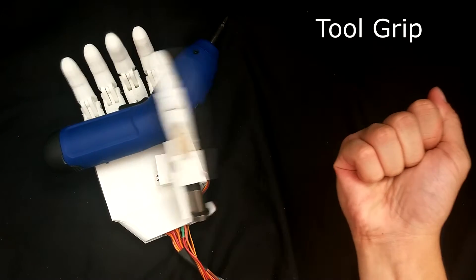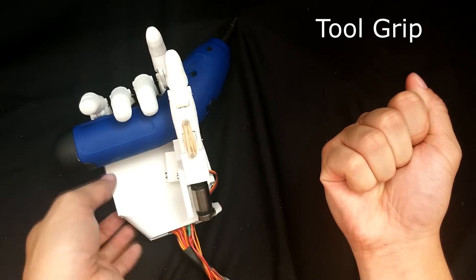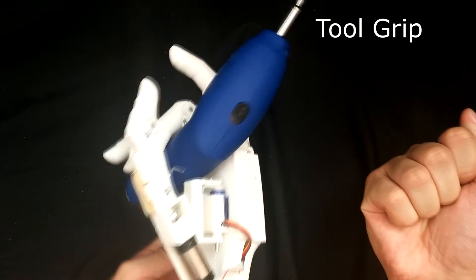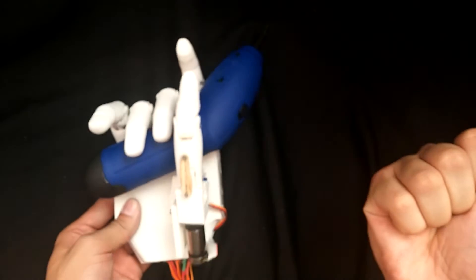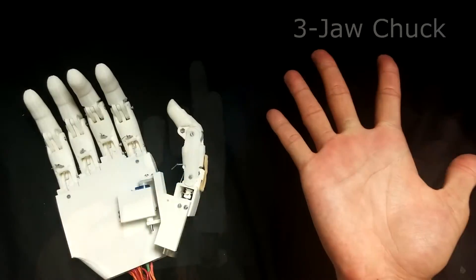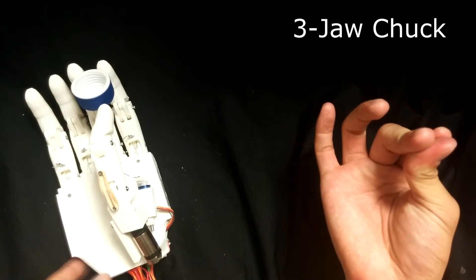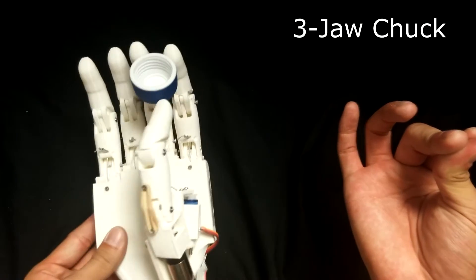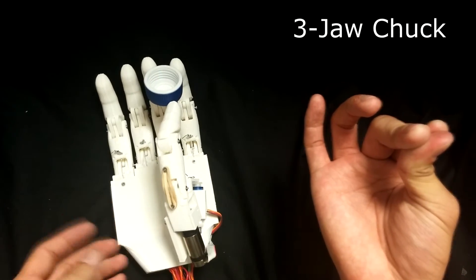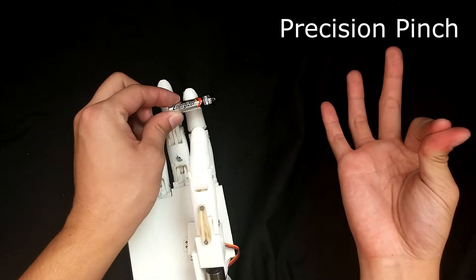Here we show an unimpaired subject performing a tool grip to hold a drill, a three jaw chuck to hold a bottle cap, and a precision pinch to hold the battery.